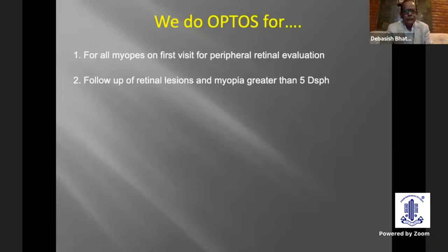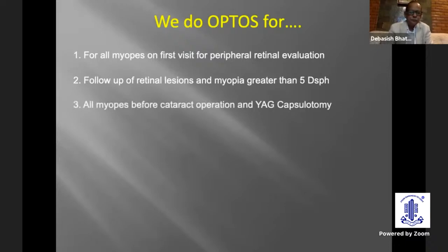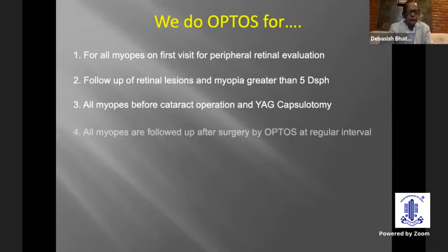So then we can follow up the retinal lesions, and myopia greater than 5, as we all know, are risky, and therefore we follow it up frequently. All myopes before cataract operation or YAG capsulotomy, we do follow it up, and also after operation, and all after a myopic cataract surgery, we follow them up regularly with OPTOS. All cases of flashes and floaters in Disha goes through OPTOS.